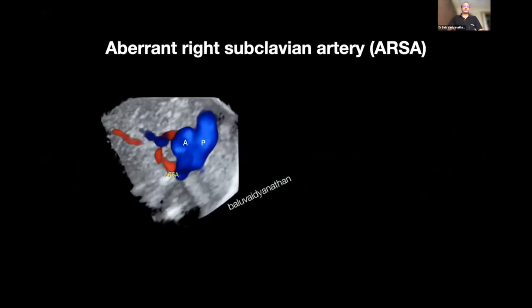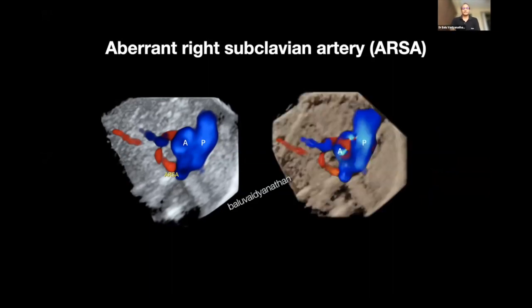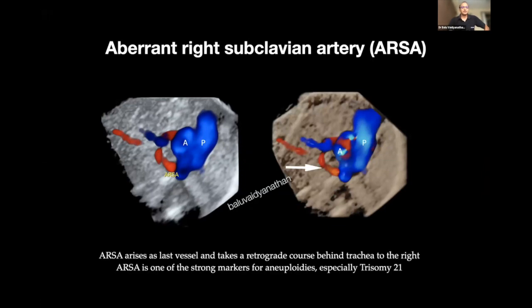The last lesion is ARSA — aberrant right subclavian artery. ARSA is diagnosed in the three vessel tracheal view. Normally you see the blue flow, but with ARSA you see an additional vessel going towards the right and posterior to the trachea. The 3D rendering also demonstrates this very well. ARSA takes a retrograde course behind the trachea and goes towards the right side — that is the diagnostic clue.